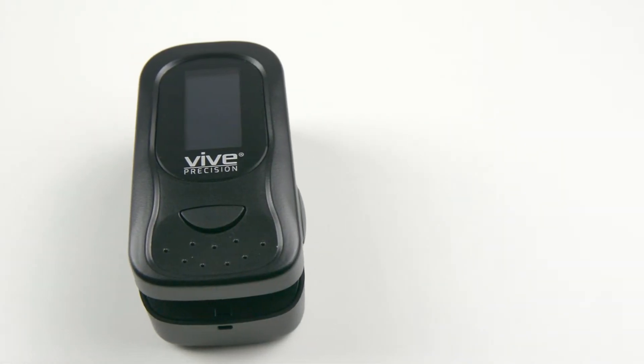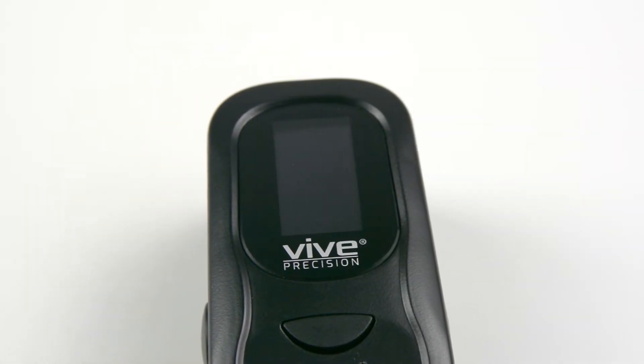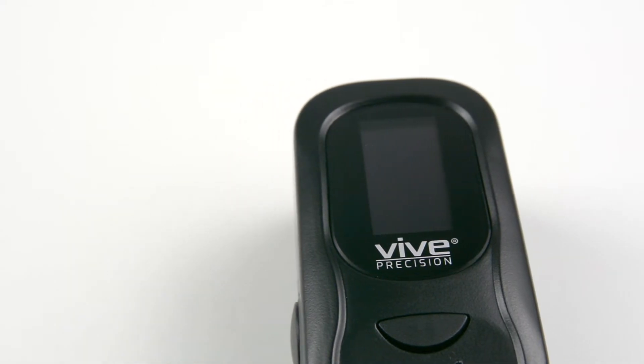Meet the Vive Precision Pulse Oximeter, allowing you to conveniently measure your oxygen levels at home or on the go.